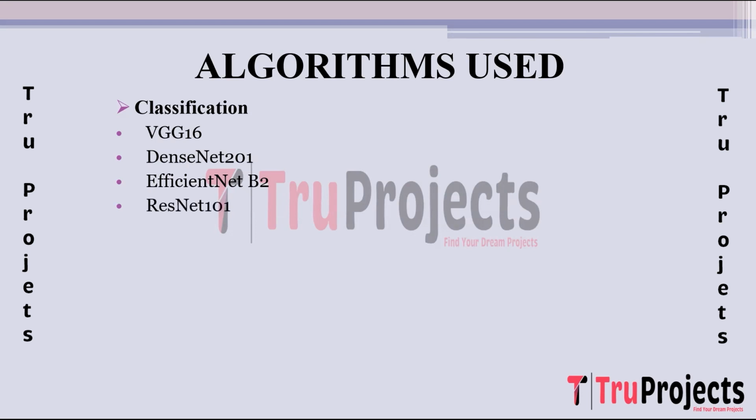ResNet 101. ResNet, residual network, introduced residual connections to tackle the vanishing gradient problem in very deep neural networks. ResNet 101 specifically refers to a ResNet architecture with 101 layers capable of learning complex features and patterns.